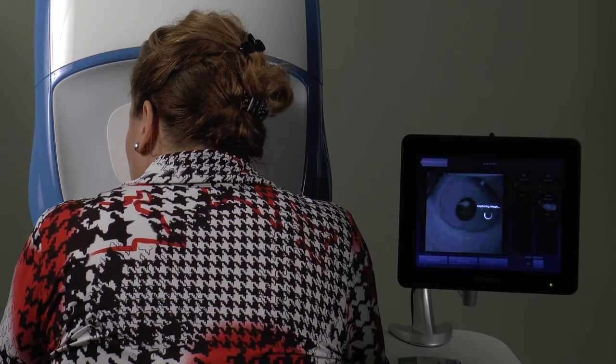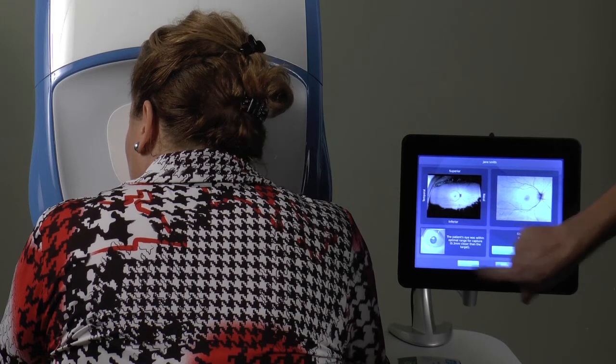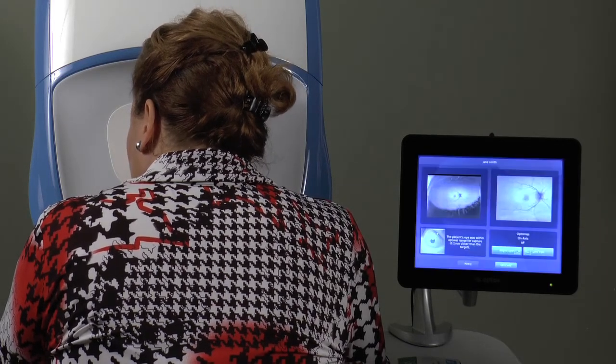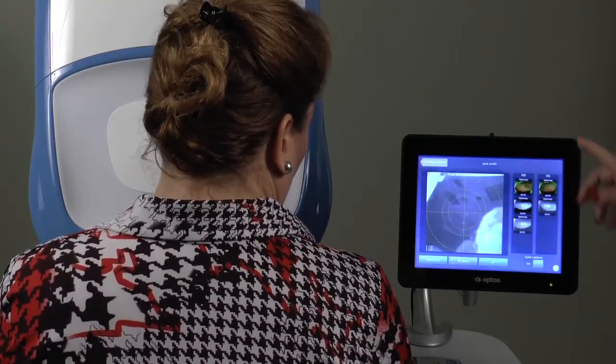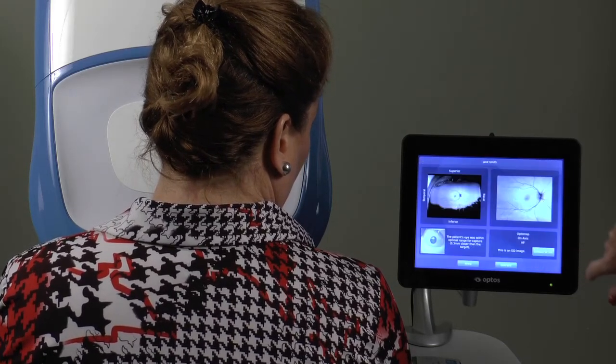If you are not satisfied with an image, you can keep it and take another image. At the end of the session, you can select any images you wish to discard by tapping the thumbnail, then select Discard and Delete.